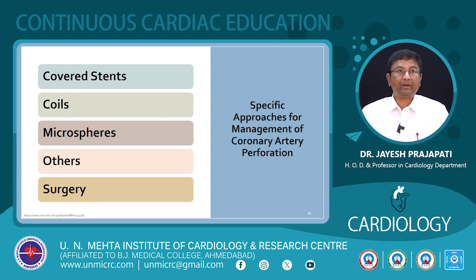If there is a distal perforation, we can use coils, micro coils for the distal coronary perforation. We can inject microspheres or the emboli like gel form, autologous blood, same clot. You inject it with some of the contrast media mixing, so you can visualize it, or you can use subcutaneous fat particles, so that can also be injected with a micro catheter. Go with a micro catheter distally.